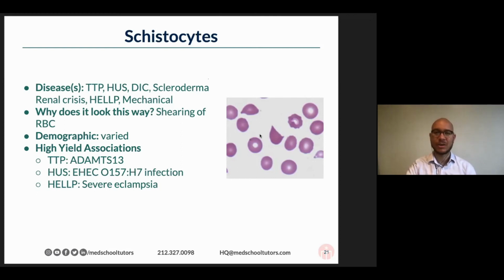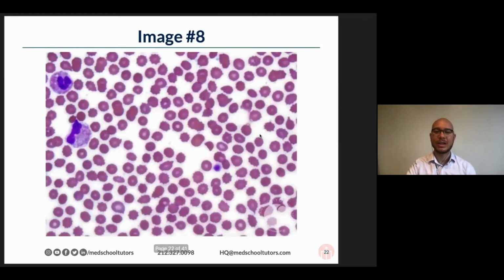All right, friends, we're about halfway through. We're going to keep this going. This image should look familiar to you. It should look very familiar. What are we looking at here? And a couple people right off the gate. This is great, where we do a little bit of spaced learning.